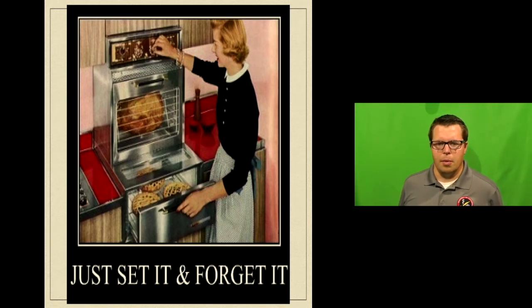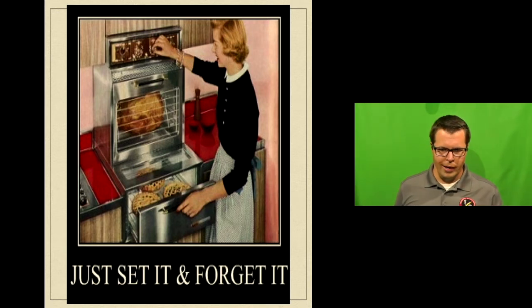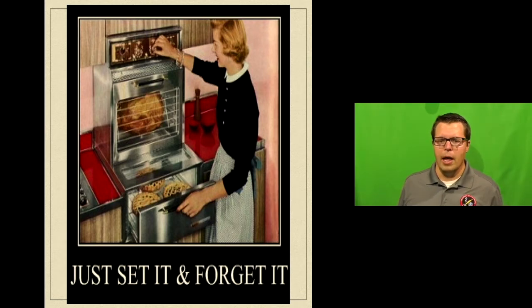Because it's going to take a couple of minutes for your settings and for the way that the ventilator is working. It's going to take a minute to actually assess how comfortable that is. Much like when you put people on BiPAP or CPAP, when you initially throw that thing on there, they may be very intolerant of it, or it may be very uncomfortable. As things improve, as their lung segments open up, and as they start to get better gas exchange, people tend to feel better with it, but it takes a couple of minutes.